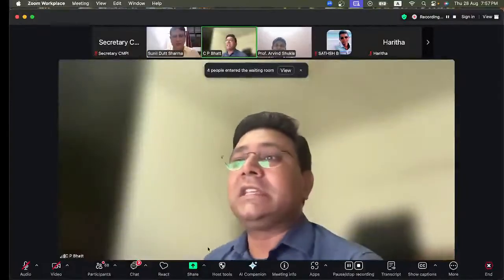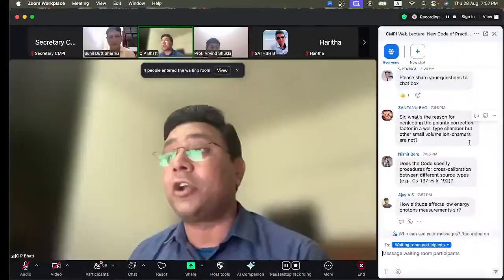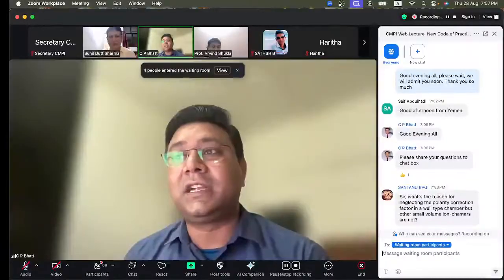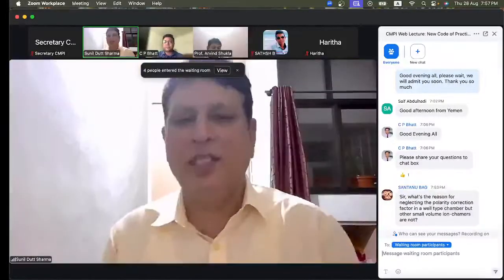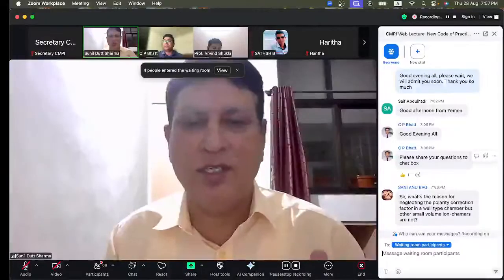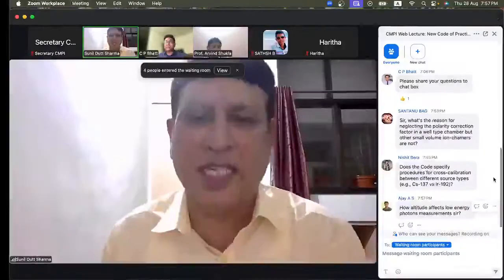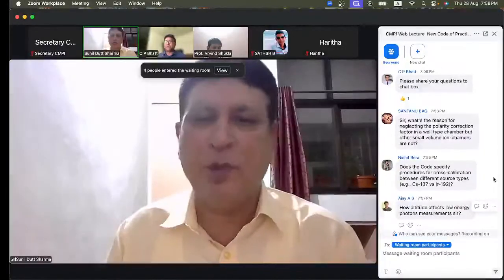And another question is, does the code specify a procedure for cross calibration between different sources like cesium 137 or iridium 192? No. We are not so knowledgeable at this moment of time. We do not have that much data. They allow the cross calibration for the same type of radionuclide.